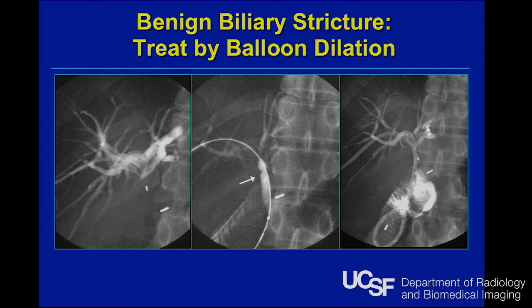Then there's a whole slew of newer devices. There are these mitomycin-coated balloons that there has been some interest in using for benign biliary strictures. And there are also cutting balloons, which have 4 sharp blades that are welded onto the balloon, and you basically blow up the balloon. You score the strictured tissue, and then you blow it up with an even larger balloon, making larger tears, and hopefully that's interrupting the scar tissue.